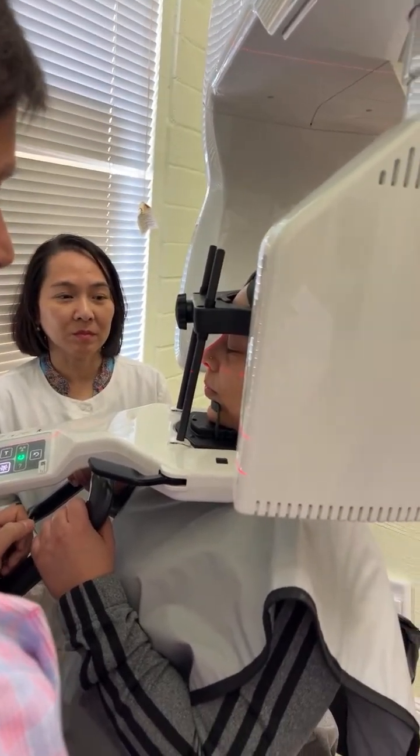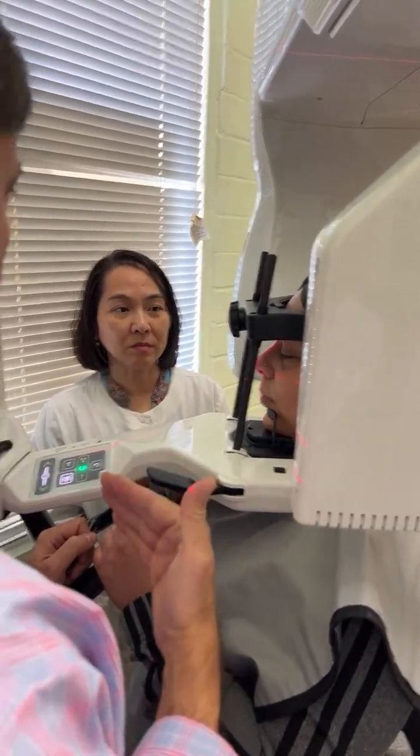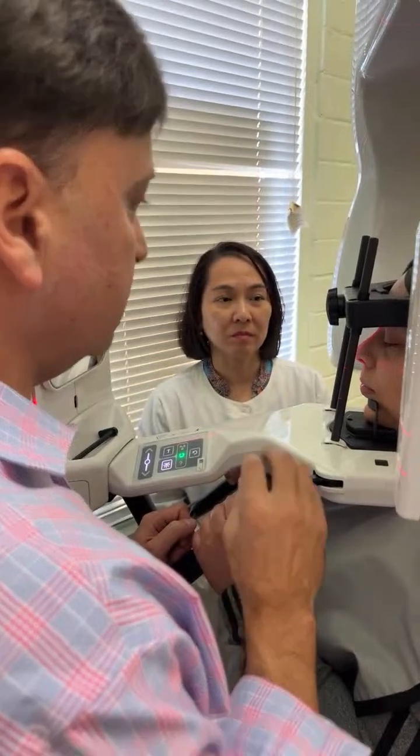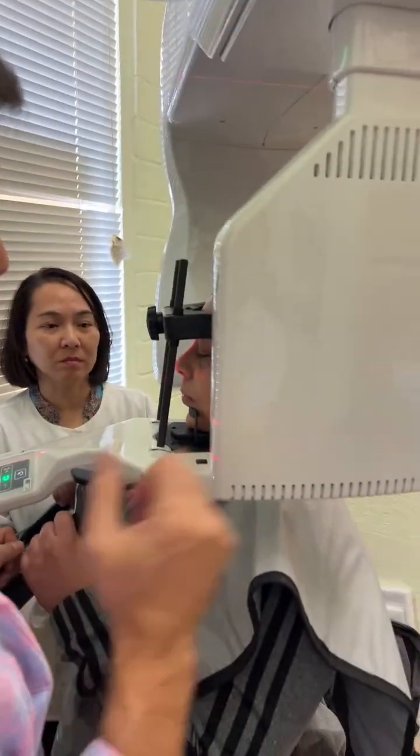Okay, all right, so now you're just going to do this for repetition: swallow, tongue to the roof of the mouth. There is no bite stick, just keep your mouth closed like that. So now we're going to do a scout, and we're going to see if this is what we want. Let's go check it out. Try not to move, stay still. Okay, and it is set up for a scout.